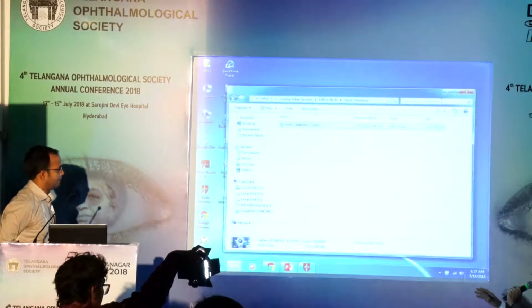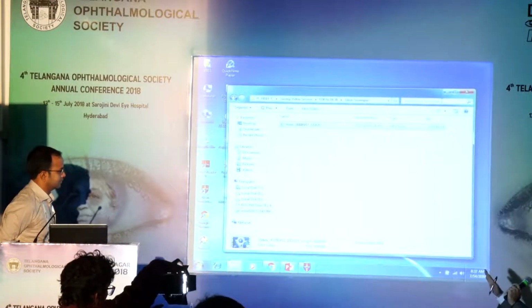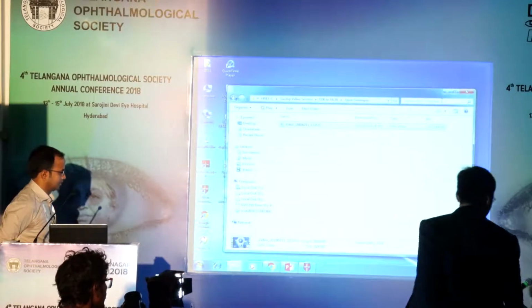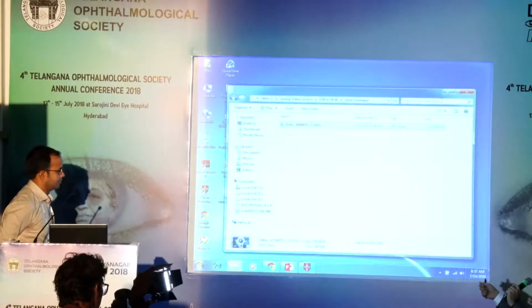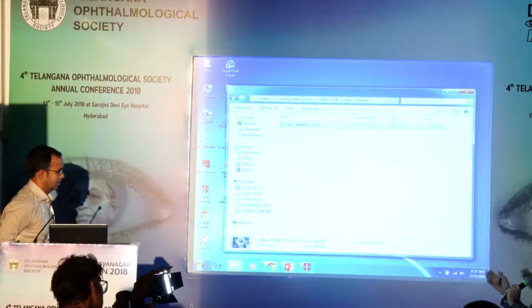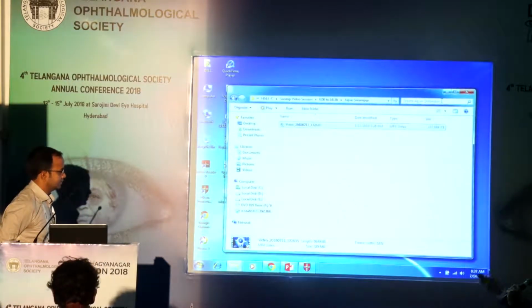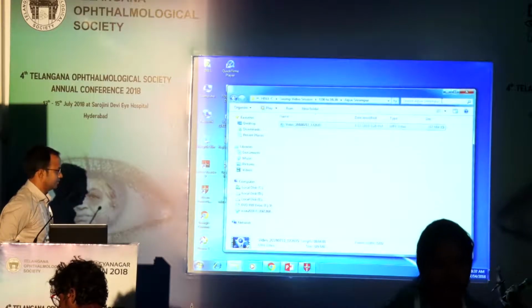Second thing is, actually this technique has no purpose. No offense, but in a lamellar keratoplasty, tuck-in makes sense. In a penetrating keratoplasty, you're still suturing at the 8 millimeter margin. You're not suturing at the posterior margin. So it's not like your sutures will induce lesser astigmatism, because where you're suturing is the same size. Also, you're not getting the benefit of those additional endothelial cells because you're tucking them under the pocket. So it's not like a top hat either.